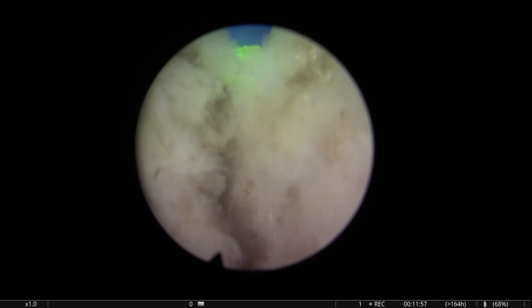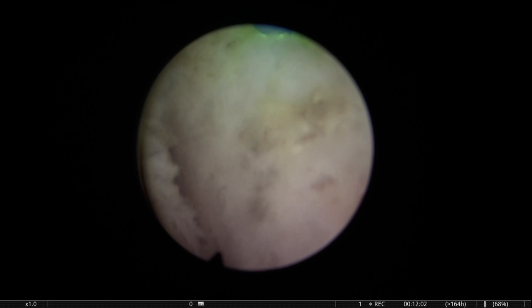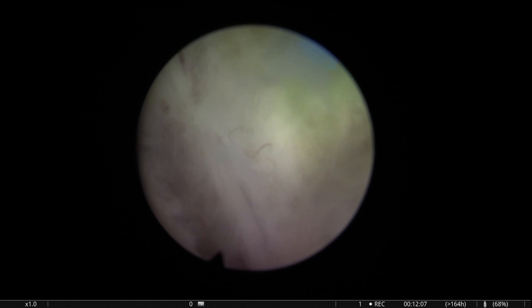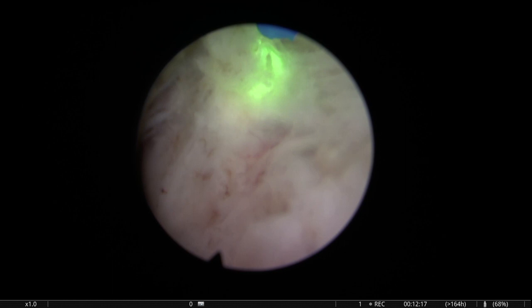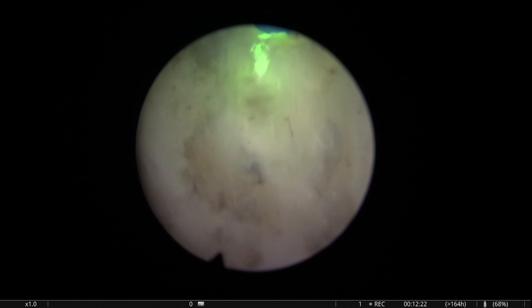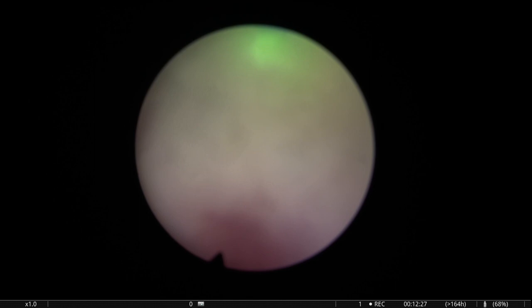You see, if you see that the tissue doesn't look like capsule or it looks a little bit bumpy, there's a bump on the tissue that looks like a nodule, then you have to test, you have to see if you can raise up these nodules. These BPH nodules sometimes grow into the peripheral zone, so when you remove them, they're going to leave a footprint, a depression on the peripheral zone. So this was specifically, I think, more difficult than usual.